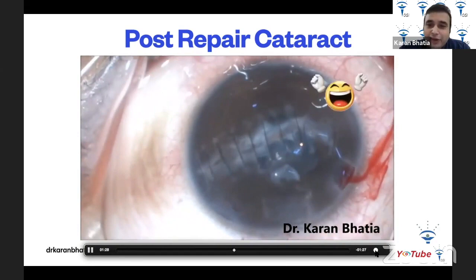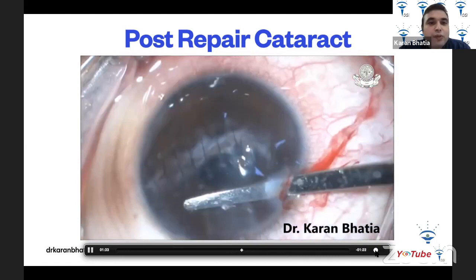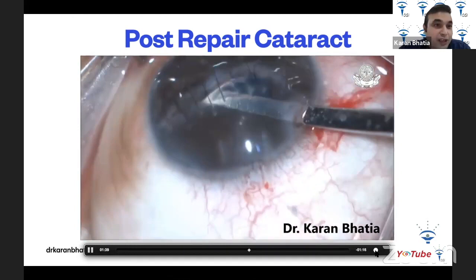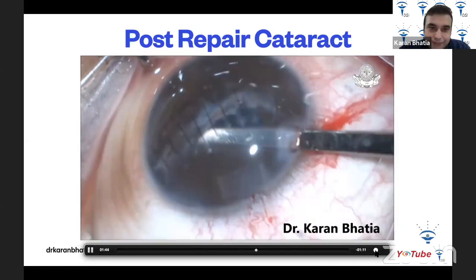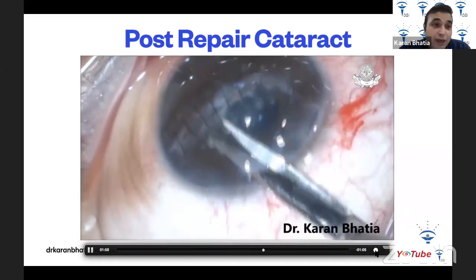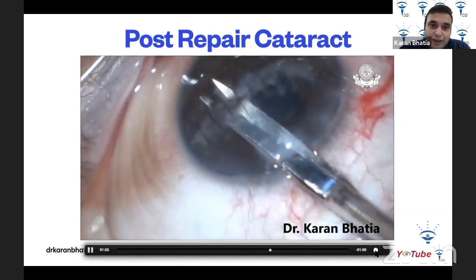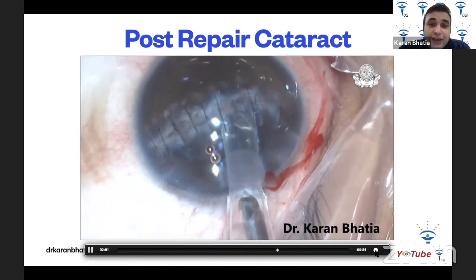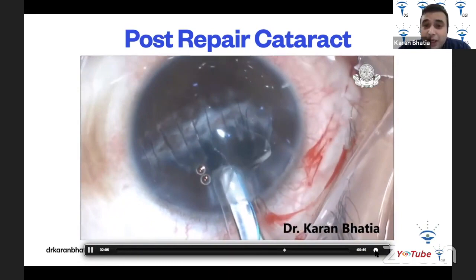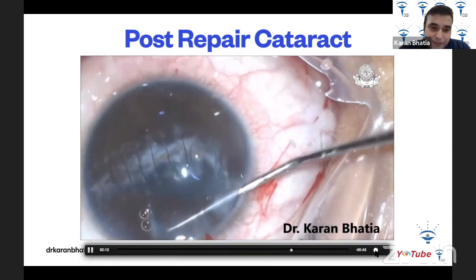The plaque is thick and care is needed. Once the plaque is removed, the iris is reposited — it was adherent to the back of the cornea, so very gentle handling is required to avoid iridodialysis. The adherent part is cut with Vannas scissors. This iris was left in place earlier because it acted as an iris hook, providing a good view, followed by implantation of a three-piece foldable IOL into the sulcus.